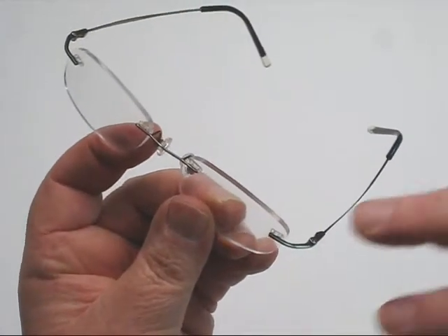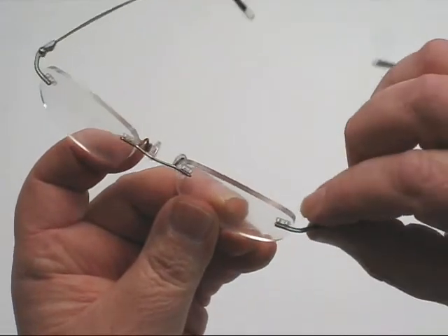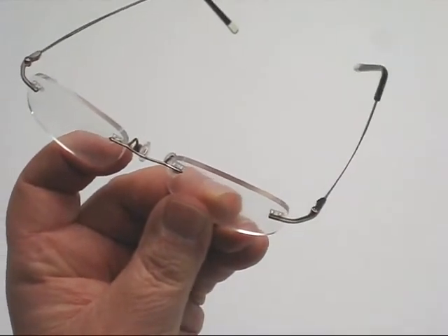And now you've completely replaced and refurbished this compression rimless mounted frame.